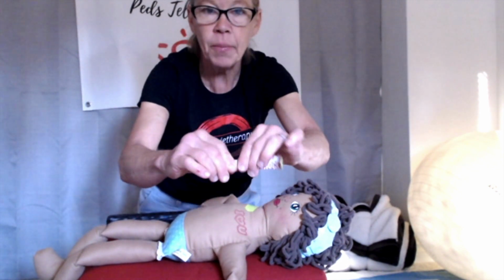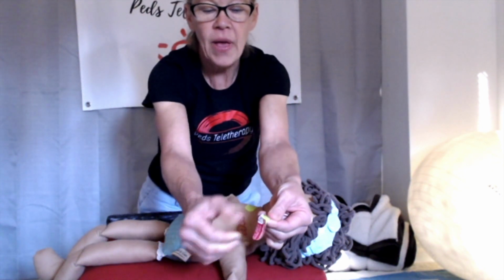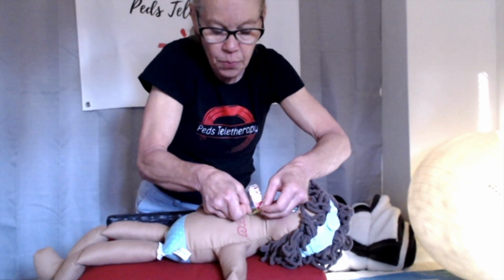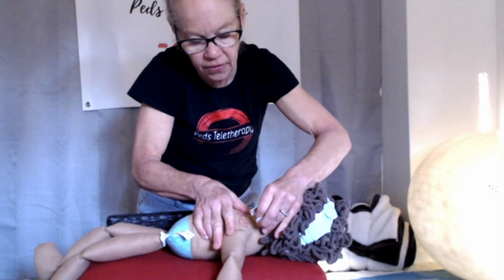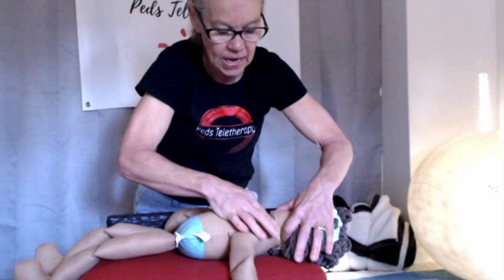When you rip your tape, just rip the paper, peel that off. I typically start, I hold it down with my thumb, and when you pull off the rest of the tape going towards where you want to place it, it's called paper off tension.